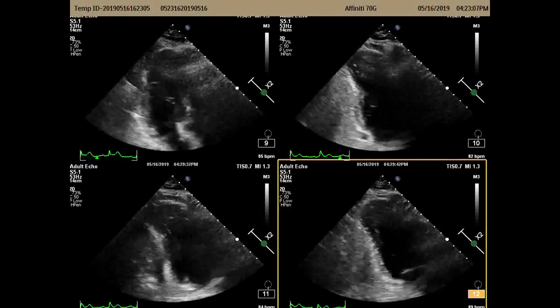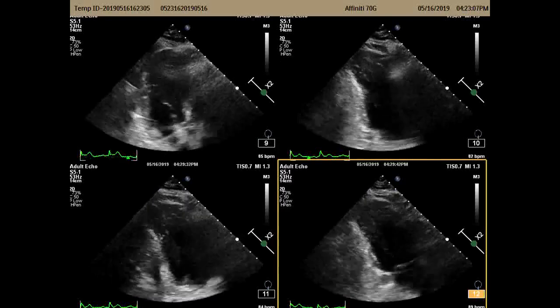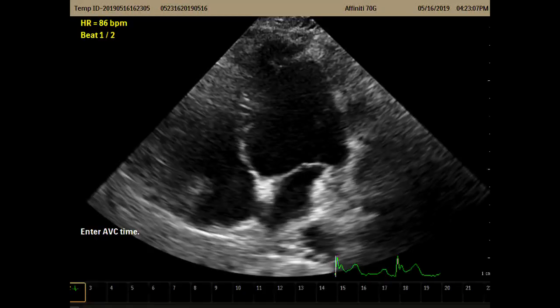And then the feature on the Philips package is called ACMQ, so you're going to hit that button. Each vendor has their own name for stuff, so obviously when you buy this stuff or start using it, you'll become familiar with the names. So we're going to start with the, I actually only have 2 loops in here.